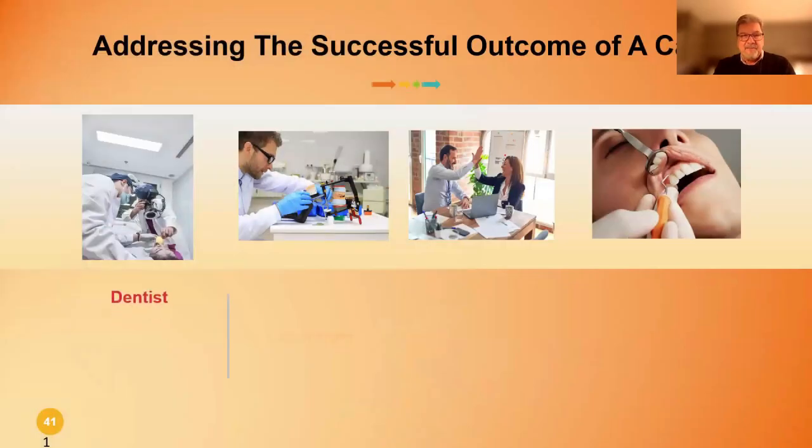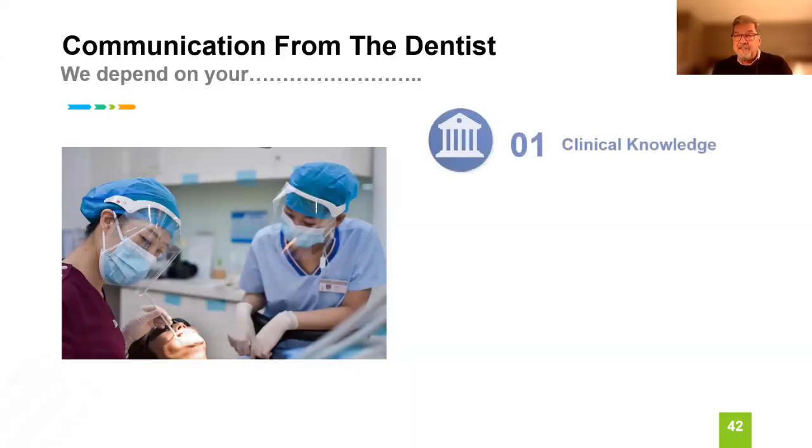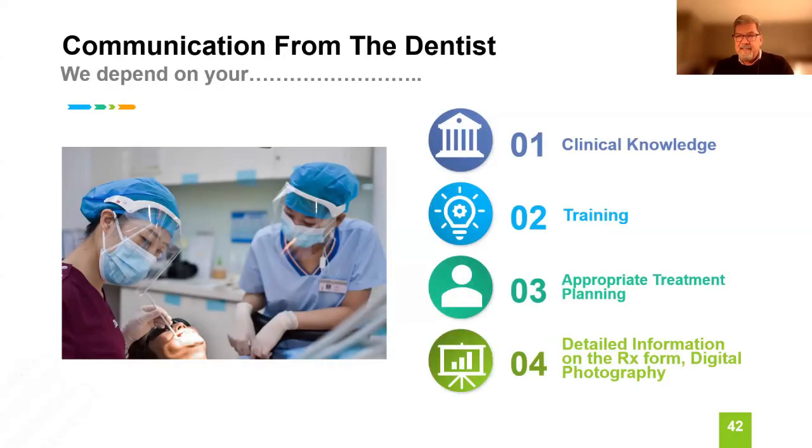Addressing the successful outcome of a case, the collaboration between the dentist and the laboratory, and patient expectations and outcomes is important. So, communication from the dentist: we depend on your clinical knowledge, your training, the appropriate treatment planning, and the detailed information on the RX is really essential. I love to get digital photography with each case so I can see the patient's facial features, because facial features equal tooth shape.